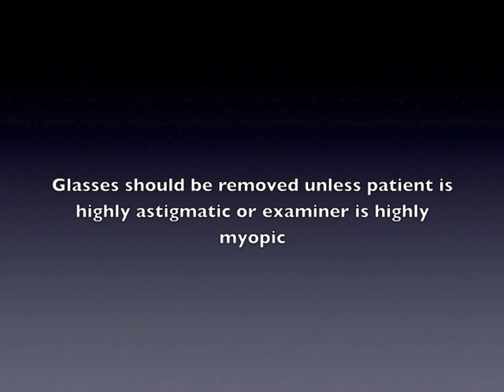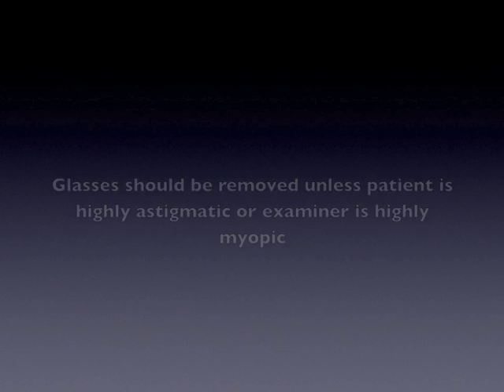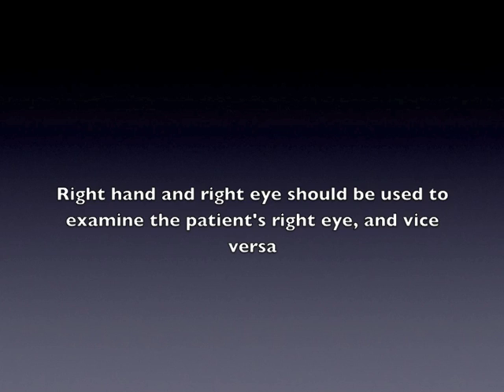The patient's glasses should be removed unless highly astigmatic, and the observer should remove glasses unless highly myopic. This allows the ophthalmoscope to be held as close as possible to the observer's eye. When examining the patient's right eye, the observer should hold the ophthalmoscope in his right hand with the right forefinger controlling the dial, and vice versa for when examining the left eye.